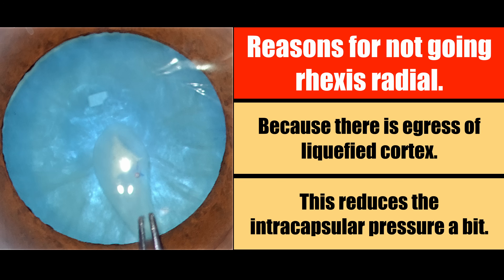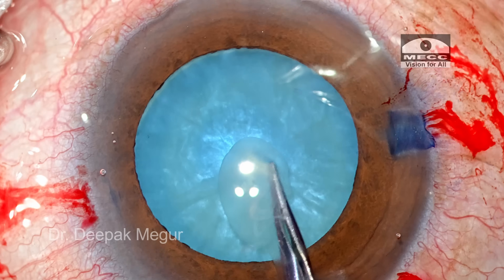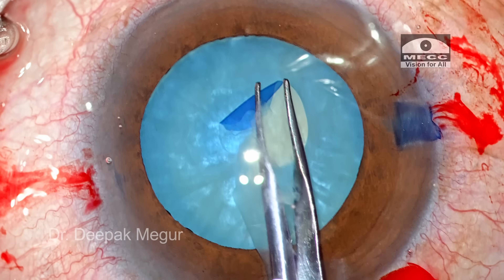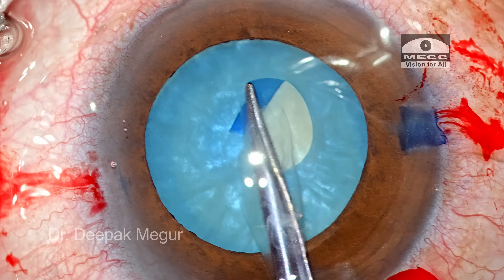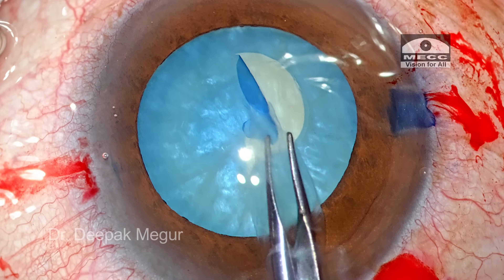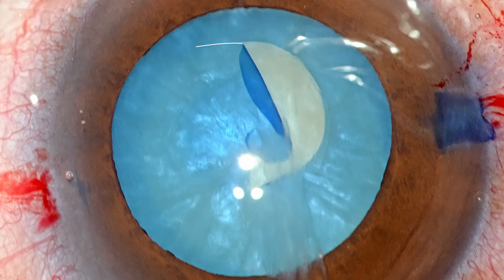Still the capsule is quite tense and the tear is irregular. There is always a risk of the tear which is sub-incisional running away towards the equator, so I need to be mindful of that. I quickly grab one of the flaps and begin to tear. As I go through with my first pass, I can see that the rhexis tear has changed its direction and is now vulnerable for extending to the periphery.